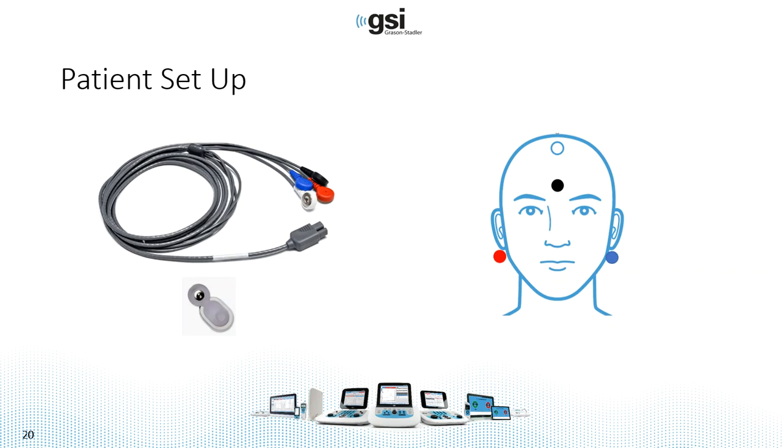So to perform an ASSR, it's easiest to use the snap lead cable, and you're going to place the electrodes as shown on the image here. The white electrode, or the positive, is going to be on the high forehead, low forehead is ground, and right and left earlobes are mastoids for the other two electrodes.